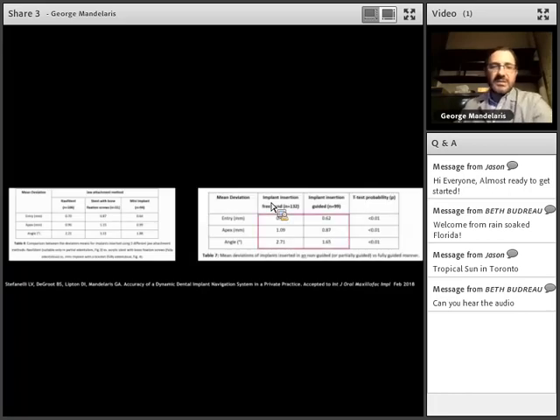I wanted to share this with you because this is probably one of the most interesting aspects. The question is really, once you've done the osteotomy site preparation, do you then need to use the implant as a drill, register the tip, and place it using the technology? And the answer is probably yes, you'd be better, but not necessarily.